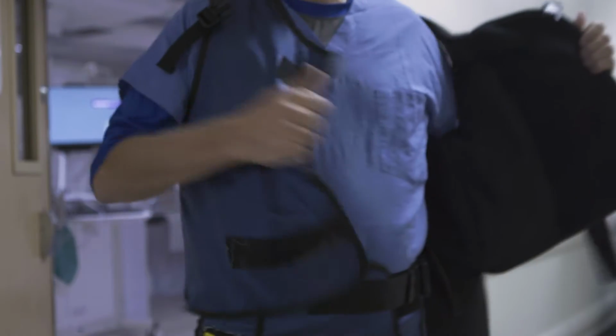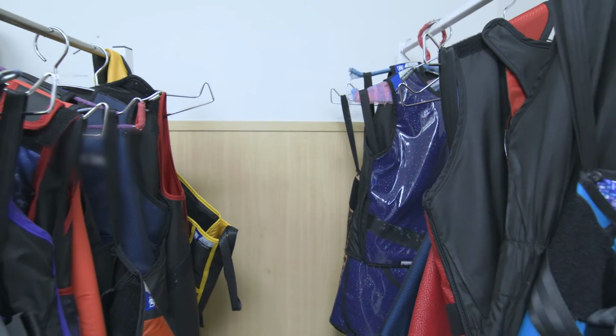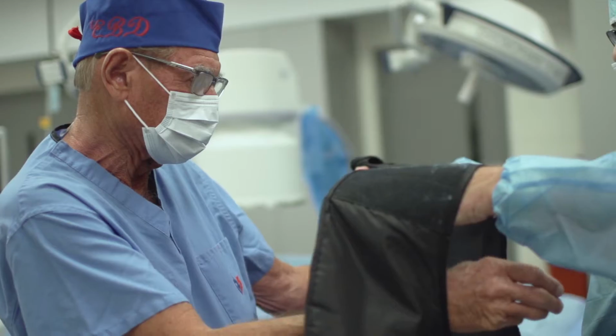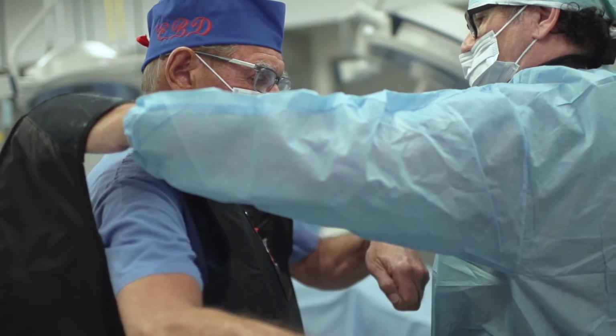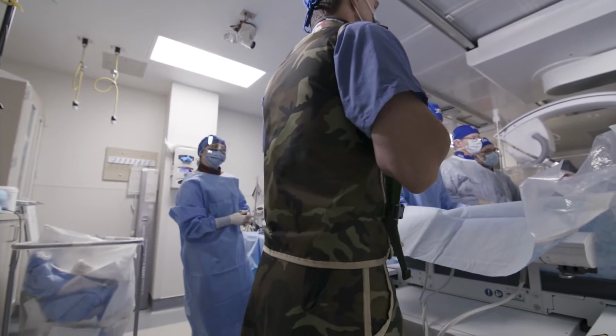There have been a number of solutions tried over the years. The most primitive solution is wearing a lead apron, for instance. If you really think about it, the X-ray lead that we wear might be thinner, it might be more ergonomic, but it's exactly the same thing. Basically, I don't feel any more protected in the cath lab today than I did in 1980. Lead vests haven't changed much in 100 years.